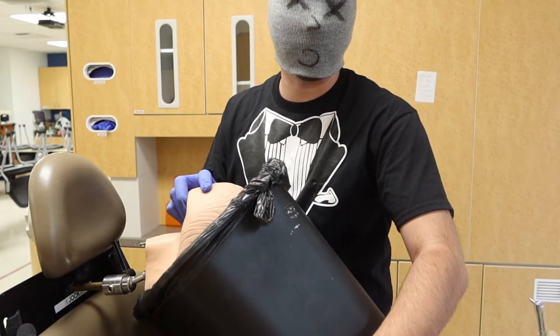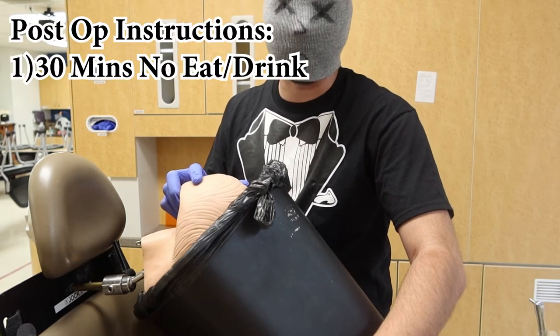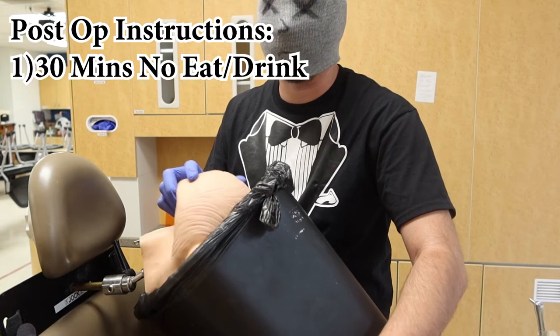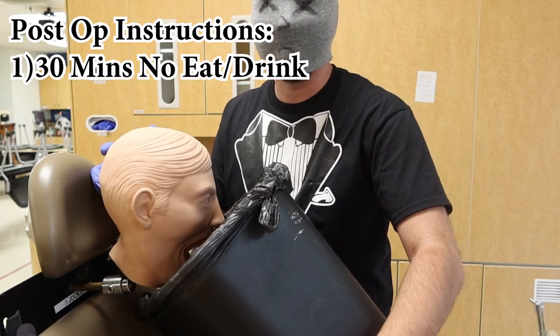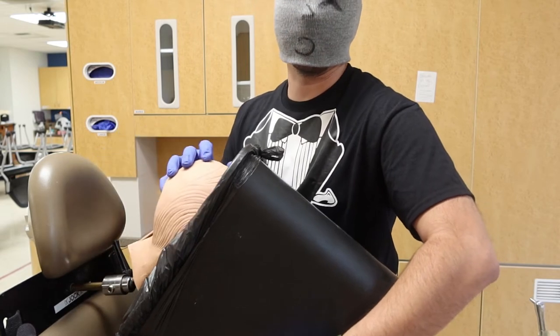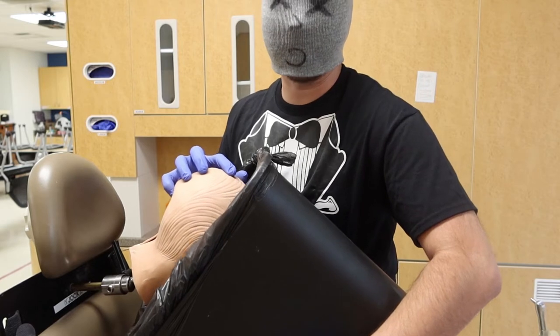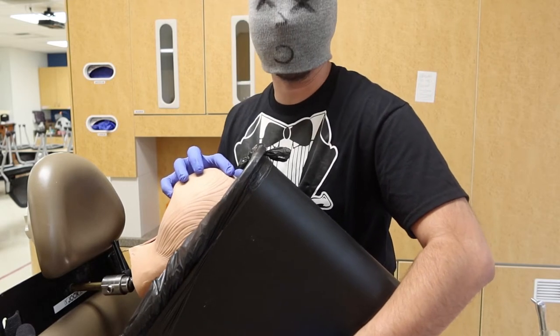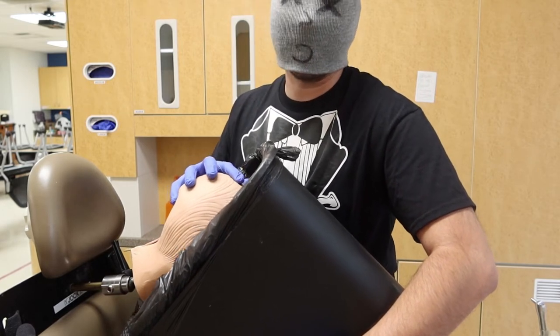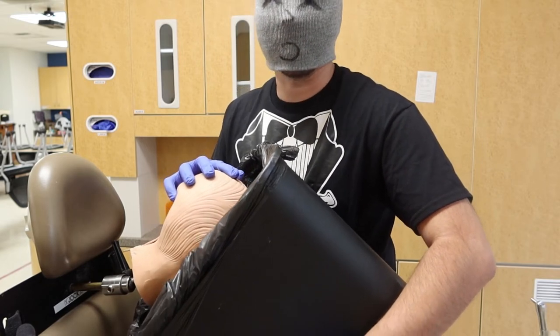Other things for post-operative instructions: don't eat or drink for about 30 minutes — that includes hot or cold water or any beverages. Make sure that you always keep the mess bucket nearby, or your HV nearby, or anything. But in the end, I'm going to be mopping this room no matter what, so kind of just sit there and enjoy the ride.